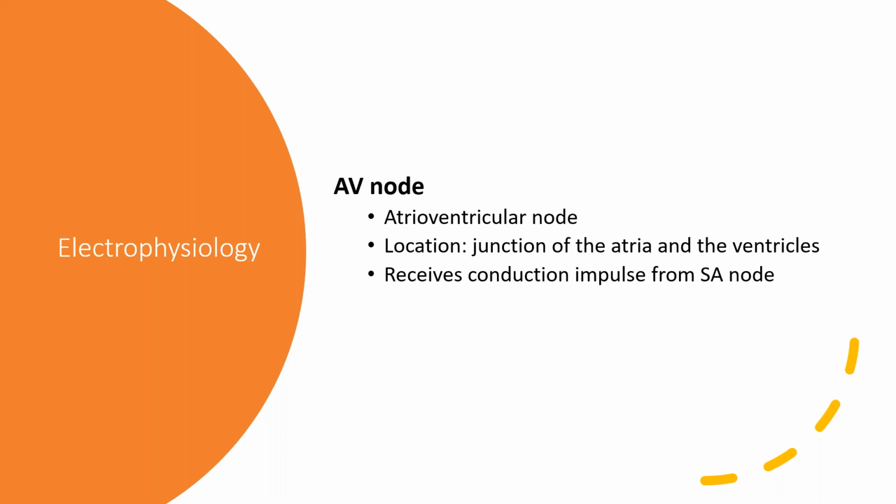One of the cool things I found out about that arrhythmia, the atrial flutter, is how they know. Looking at it, the ECG looked pretty normal, because you're used to seeing your ECG printout on your SIM when you put your patient SIM on there. I thought it looked pretty normal, just very fast. The doctor said if you flip it upside down, it looks like a sawtooth, which is how you can tell atrial flutter. I learned something by experience, by having a problem myself.